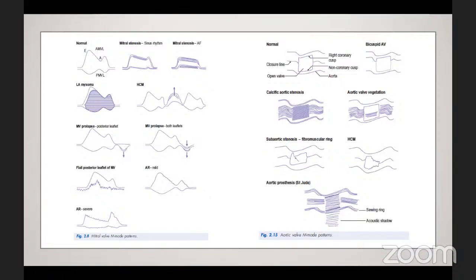We already have 2D imaging, and now 3D imaging, which has given us the full look at the valves and the structures. We don't rely on the diameters for now, but it's been there because some of the older literature has been basing LV dilation on the dimension, but the new move is that we're doing 2D, 2 dimension, 3 dimensions.